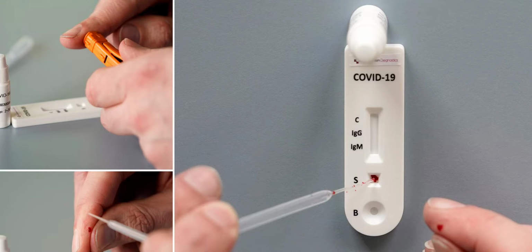Then the S port is used to load the sample, which is our blood sample, on that particular port. Then IgM, in this region we will see whether you have an IgM antibody or not. If you have an IgM antibody, you have an infection, but it is under control, or it may be in an initial stage.